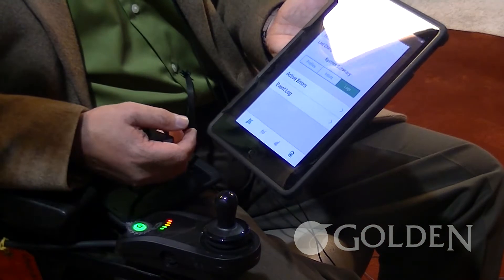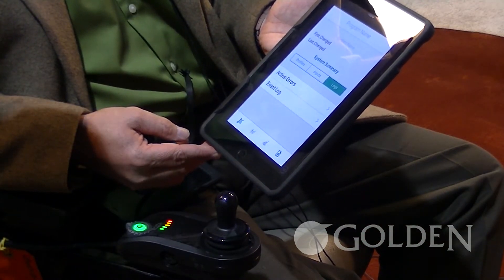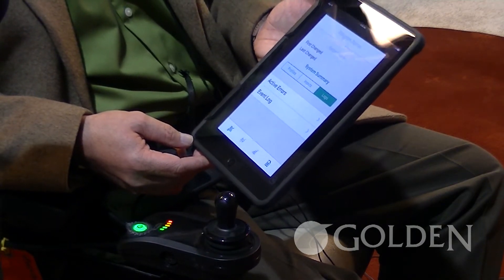What we've done is go from a 60 amp controller to a 40 amp controller, which is offering more torque and not taking as much drainage from the batteries. The chair is going to last a very long time.